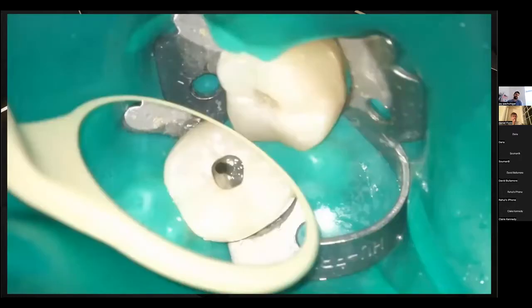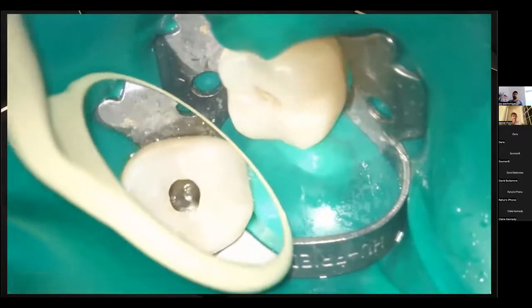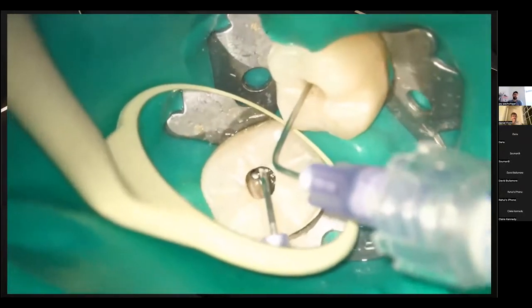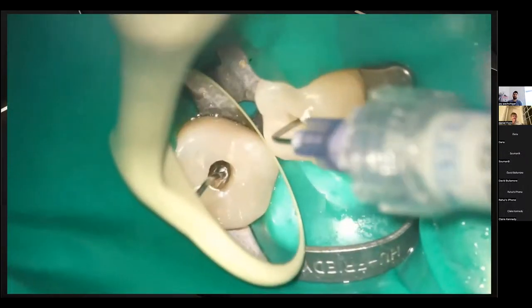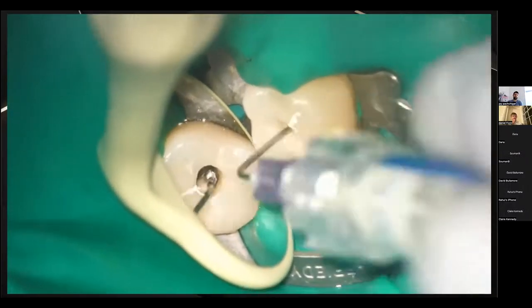So this was actually a case where, again, you'll see on the post-op. I'll just go through it first. On the distal, I do actually lock the tip into the canal. Again, this was a canal that wasn't patent. There was a lesion. I should have posted the pre-op, but it wasn't patent, and there was a radiolucency. So you'll see on the distal canal, I do lock that tip into the canal. These are just the mesials here. So I actually do lock that tip in.